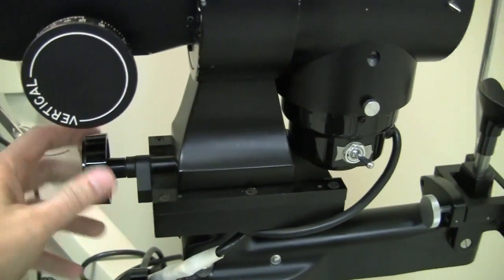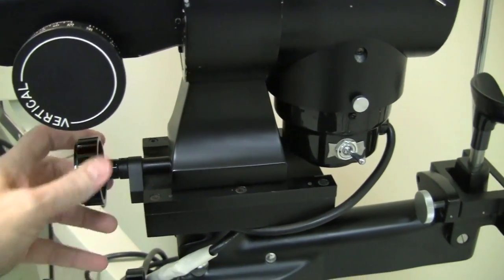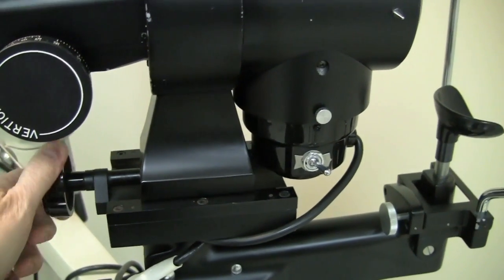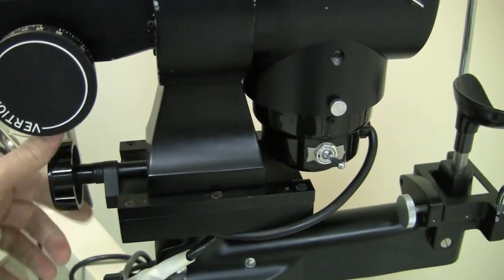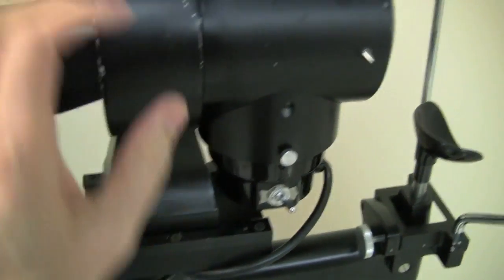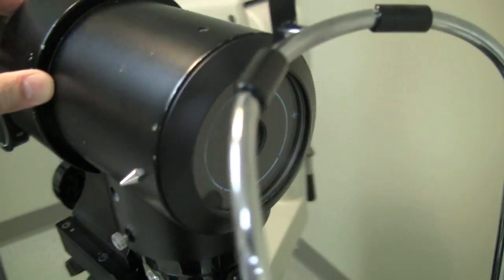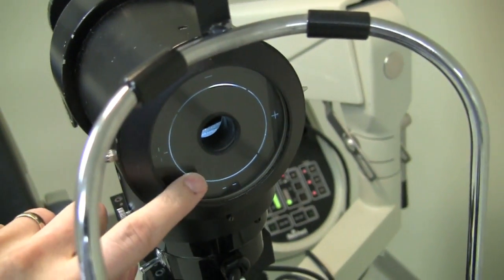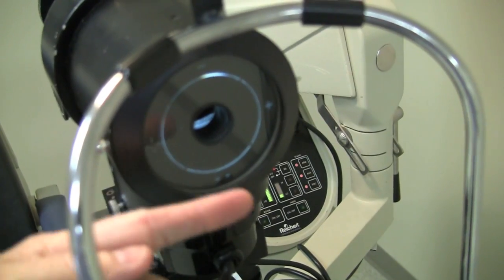This knob is also used to focus the instrument. If you turn the knob, you'll see that the whole thing is moving forward a little bit and then backwards a little bit. And the whole point of doing this is to get this end of the instrument where we have this circle closer to and farther away from the patient's cornea.